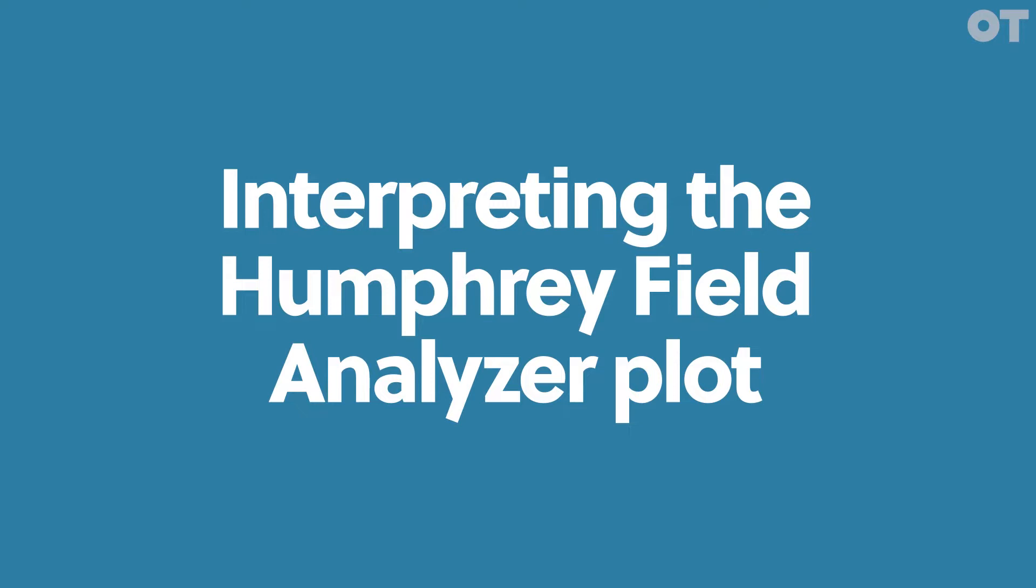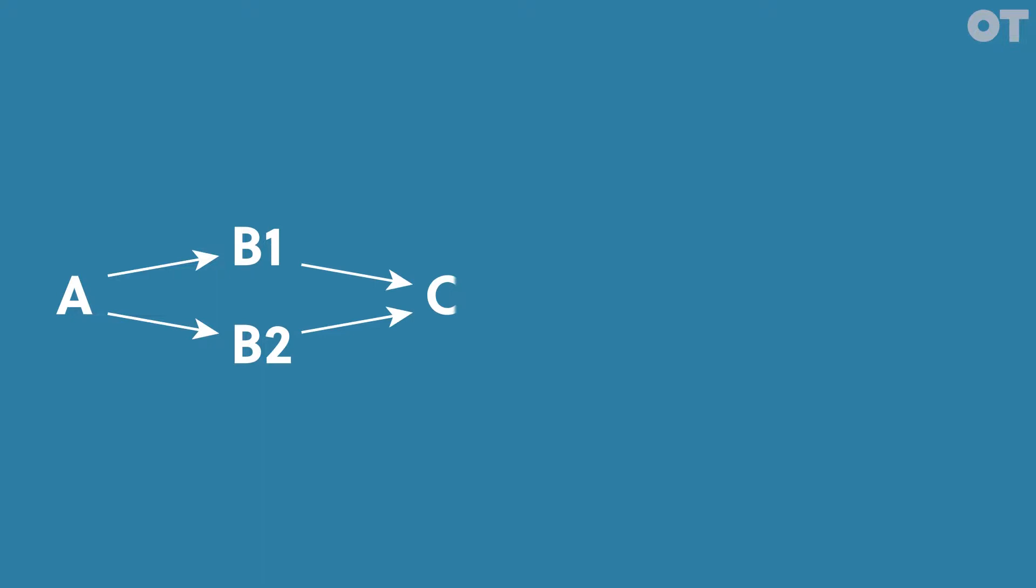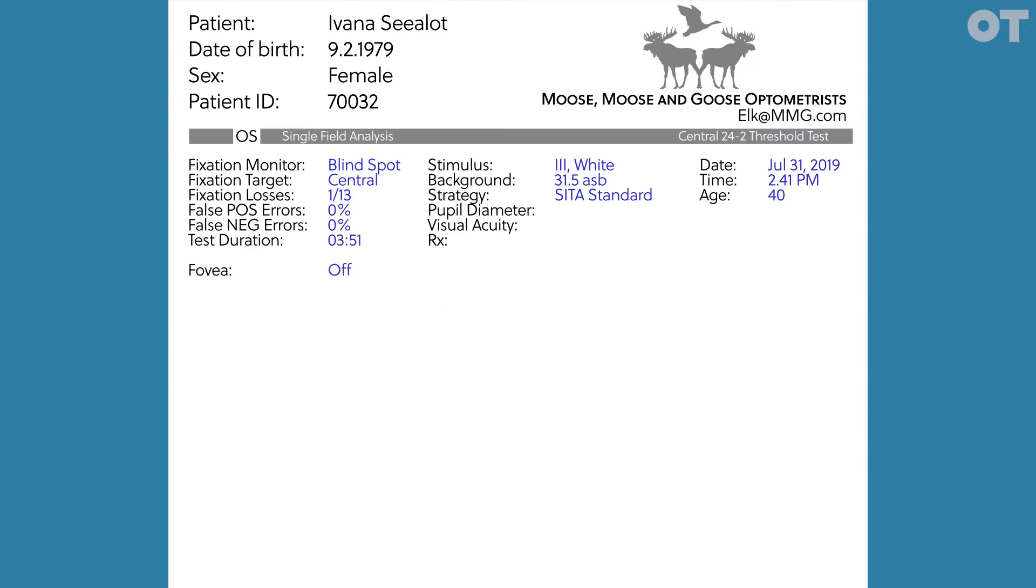Introduction to interpreting the Humphrey visual field analyzer plot. Adopting a systematic approach to the Humphrey visual field plot will help with diagnosis and avoid interpretation errors. If you didn't perform the test yourself, it can be helpful to discuss the patient's performance with the perimetrist. Did the patient seem alert throughout or struggle to maintain concentration or head position? Let's first look at the plot.